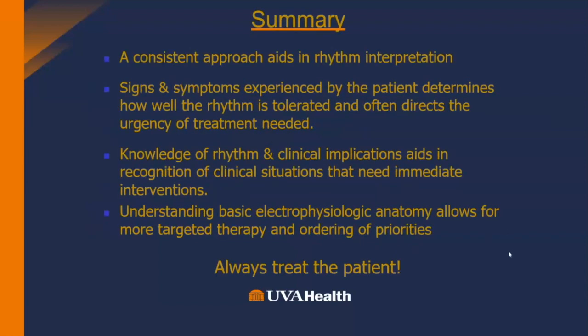That sort of summarizes our piece on rhythm recognition. You need to have a consistent approach. If you apply your techniques the same every time, you're much more likely to be successful. And knowing the etiology and the electrophysiology of the event allows you to optimize your therapies and hopefully optimize the outcome of the patient.